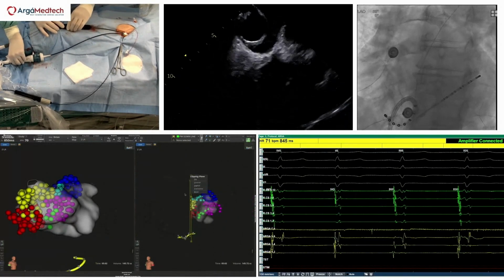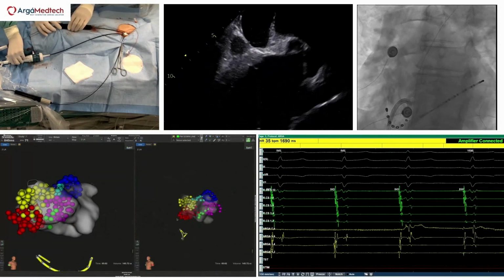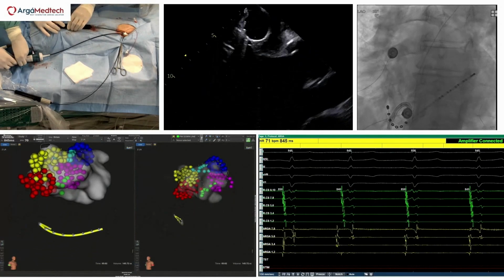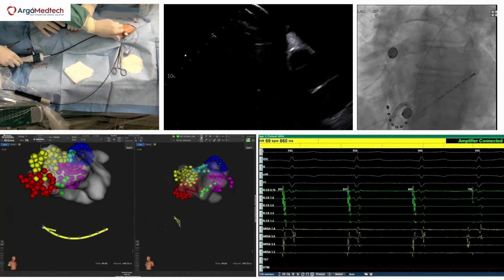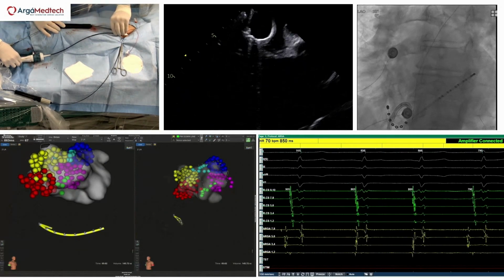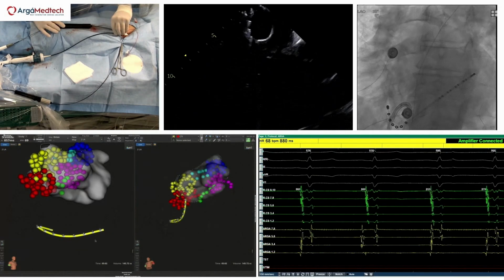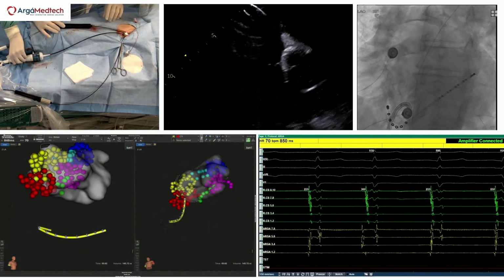Now, look at this. I like this position. Very nice position, very nice contact. And can we see the catheter? Can I rely on it? I would say, can we do Max from 7, 6, 5, 4?